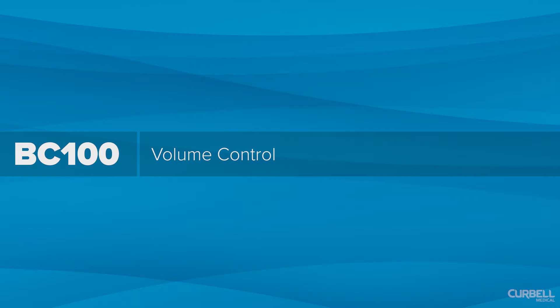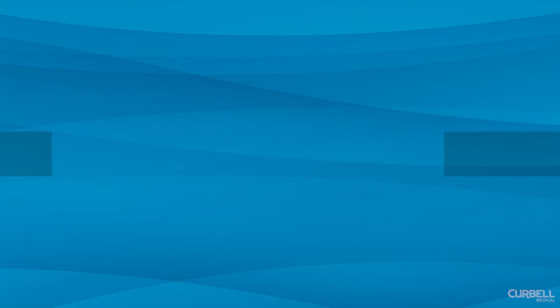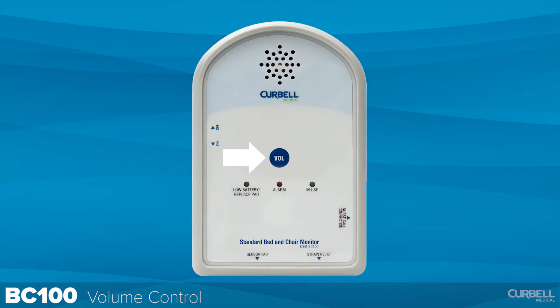Volume control. To turn the volume up, press and hold the volume button; release the button when the desired volume is reached. To turn volume down, press and release the volume button, then press the button again and hold it; release it when the desired volume is reached.